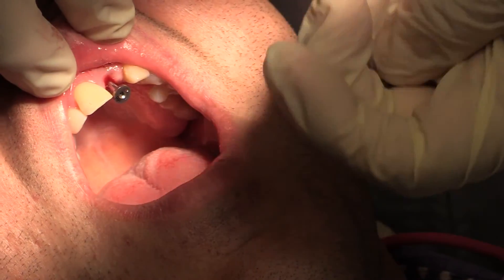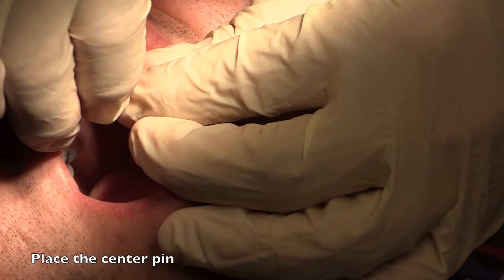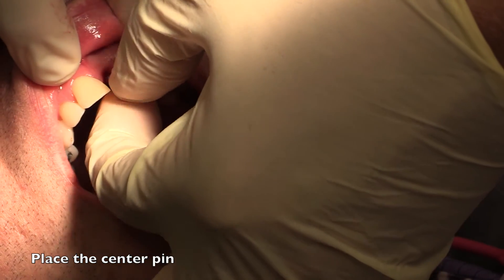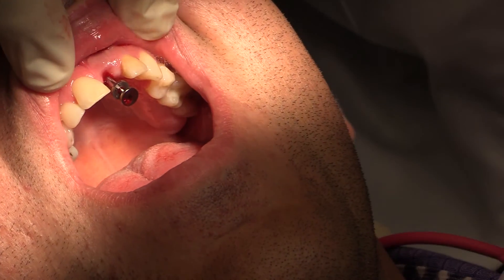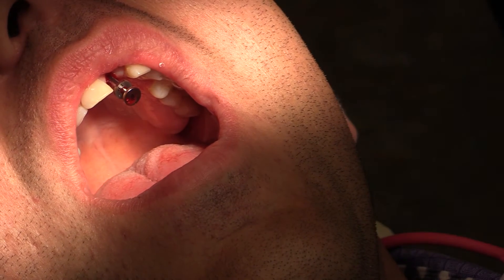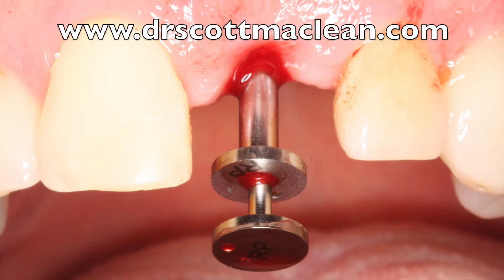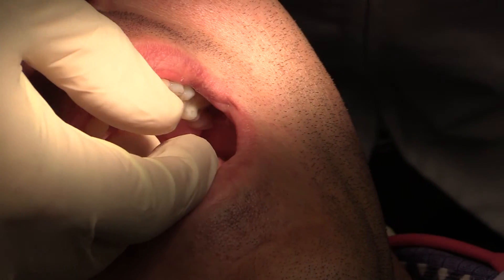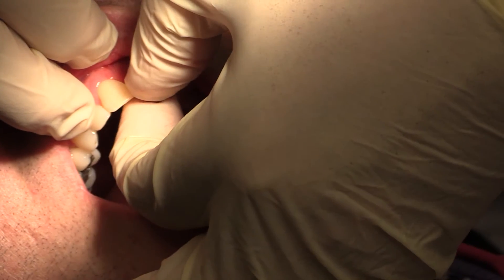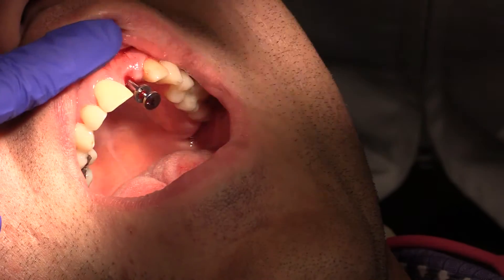Then the center pin is put back in, and when you do that it expands those two wings but also pushes on the base of the implant. So as you do this, it will lift the broken part of the abutment back up very strategically. One part sits down underneath the abutment, the center pin goes through, and it doesn't need a lot of room through the gingiva to do this. Now you take a hemostat — the hemostat is going to pinch those two aspects together and pop the abutment out. I like to check that the wings are engaging underneath the edge of the abutment before using the hemostat.